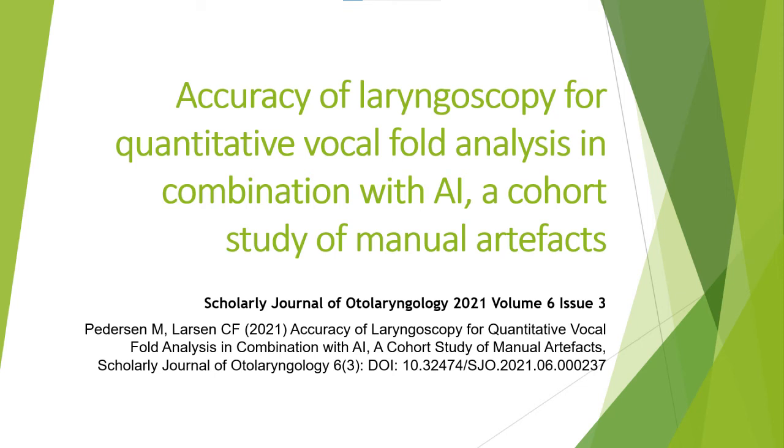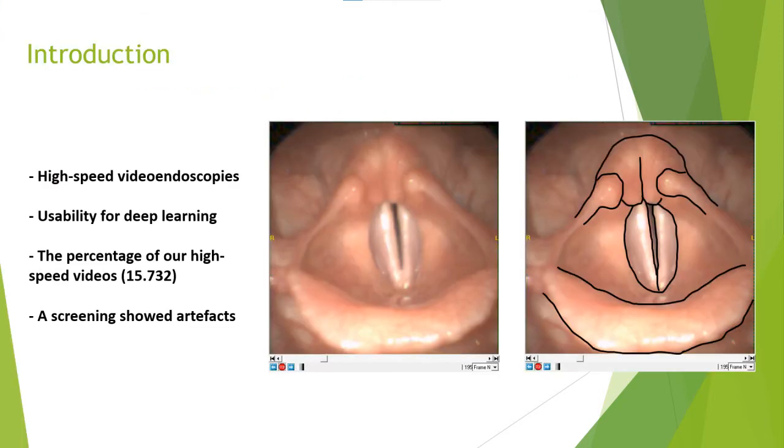Hello and welcome. Today's episode is on manual artifacts of laryngoscopy based on a recent paper. A cohort of high-speed video endoscopies was evaluated for usability for deep learning.